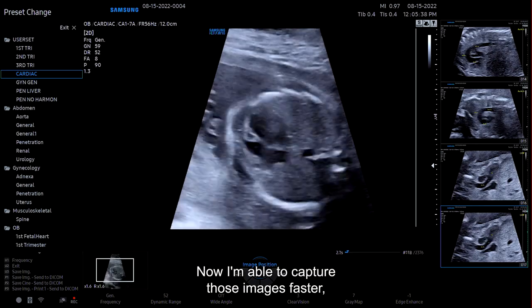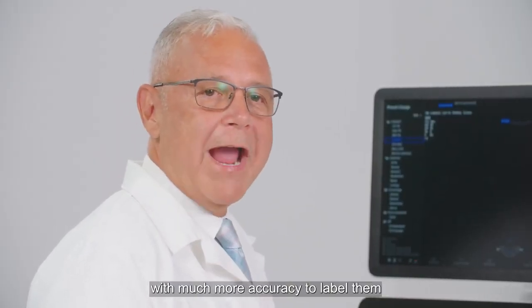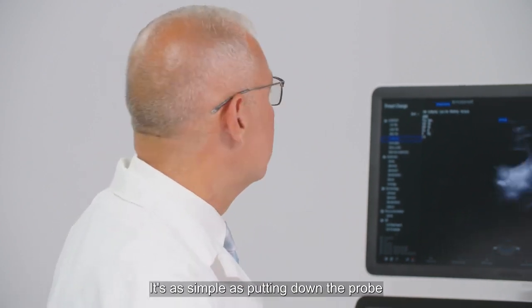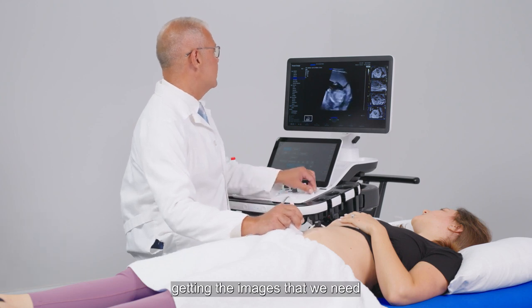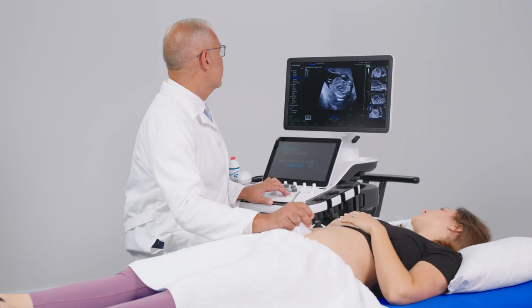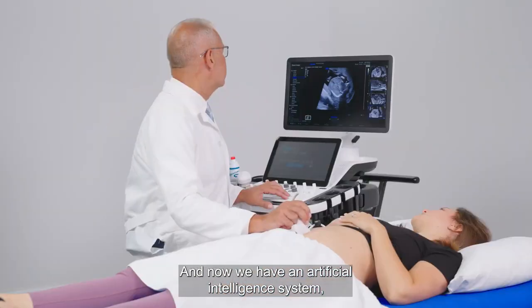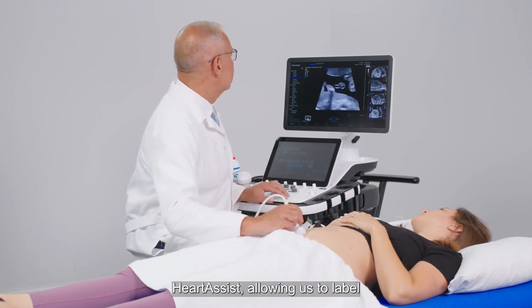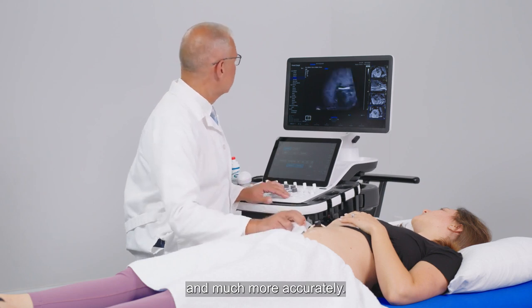Now I'm able to capture those images faster, with much more accuracy, to label them as well as to measure them. It's as simple as putting down the probe and doing what we normally do, getting the images that we need to get those cardiac views. And now we have an artificial intelligence system, HeartAssist, allowing us to label and get those views much faster and much more accurately.